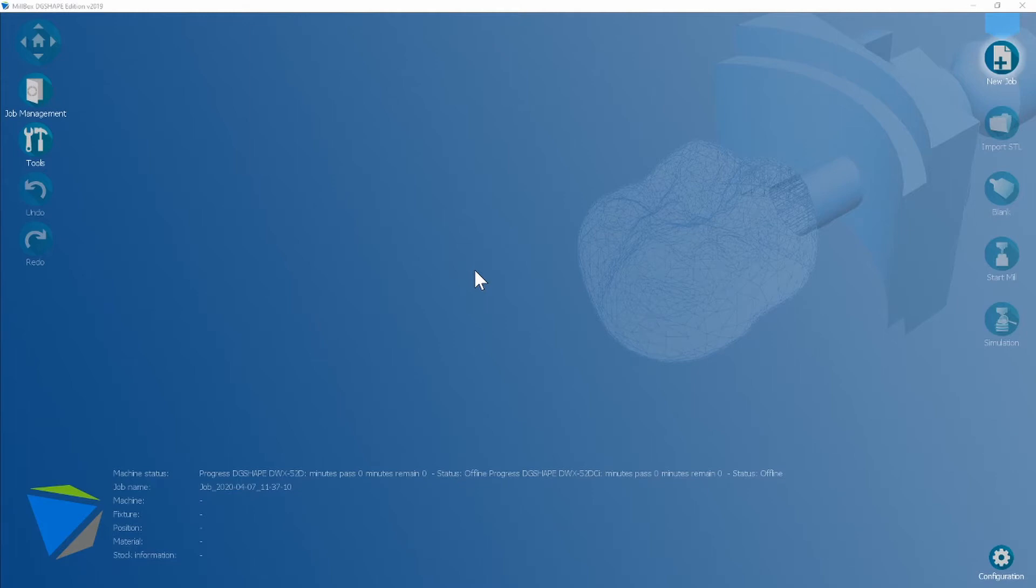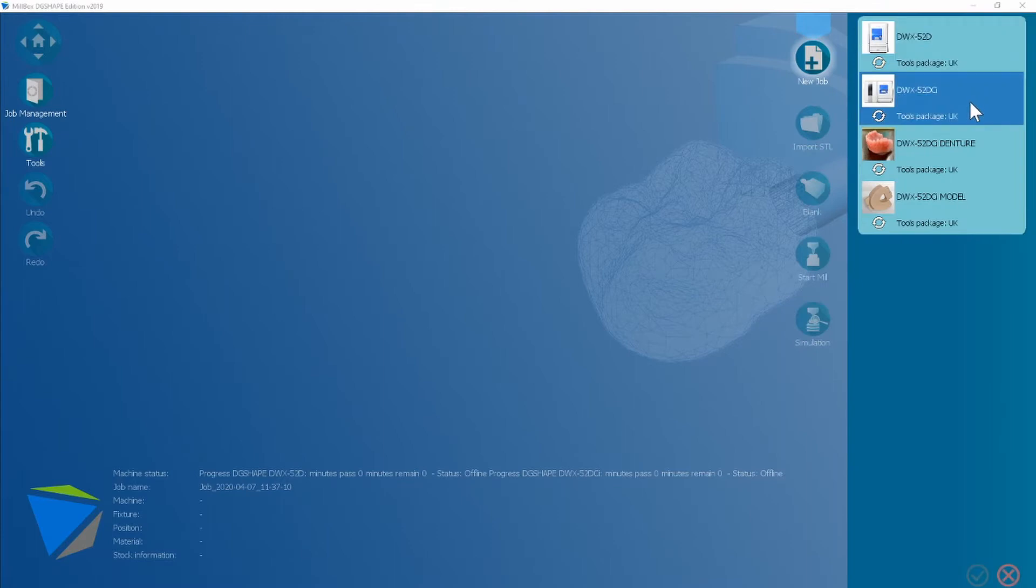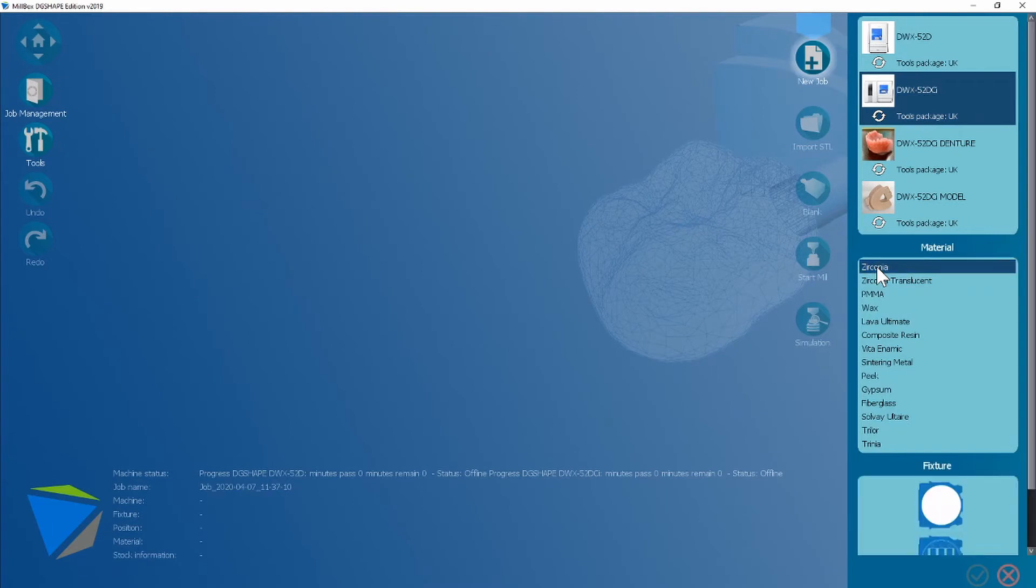There's a few little differences so we're going to begin the same workflow as last time. New job, you're going to choose your machine. If you're happy with your tool package, you're going to choose a material and then the disk fixture and then next.